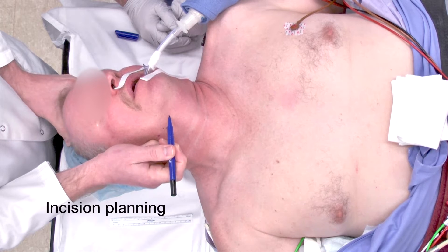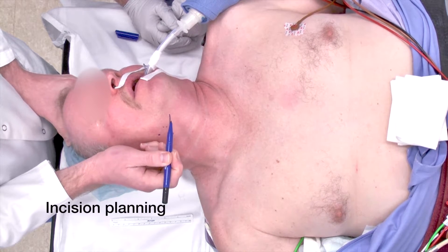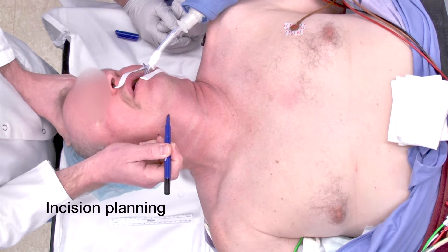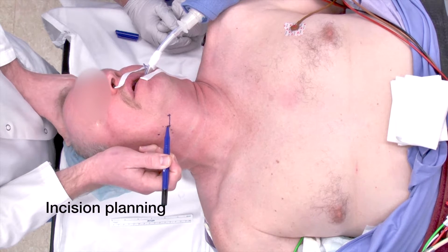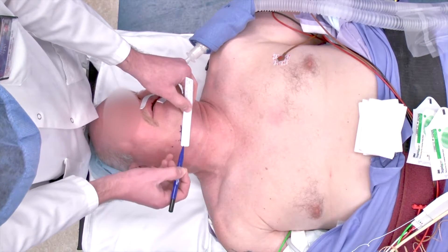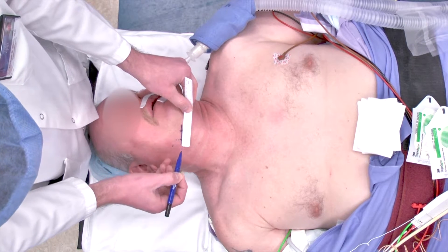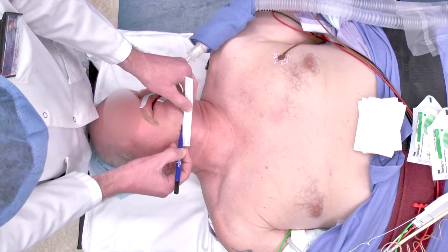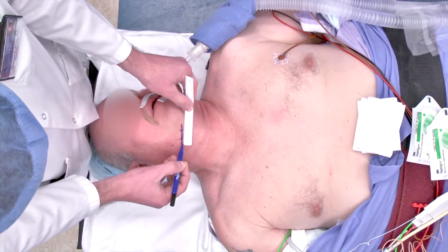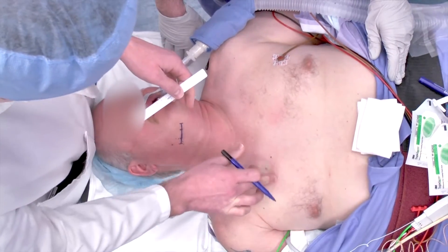The first step of the procedure is to mark out our incisions. The first incision is a small submandibular incision, which is approximately two centimeters in length. I've found this incision can be quite limited to obtain access to the hypoglossal nerve. I'll feel the mandibular notch and then mark out the incision just anterior to where I feel the submandibular gland is, approximately a finger breadth below the mandibular border.